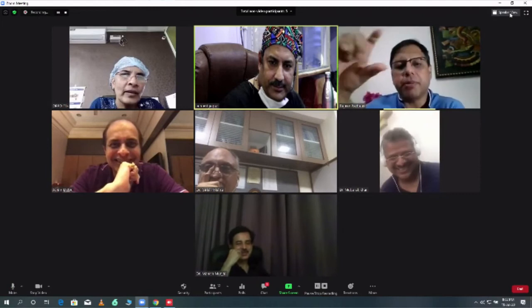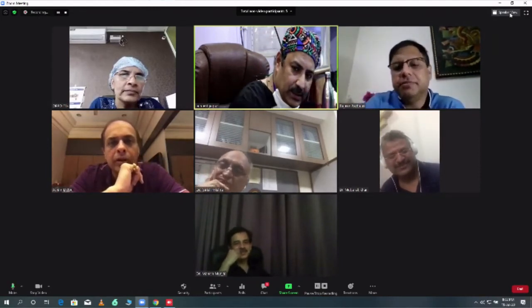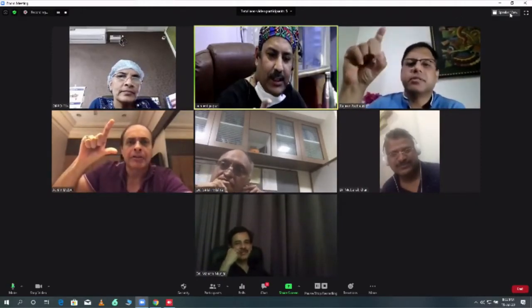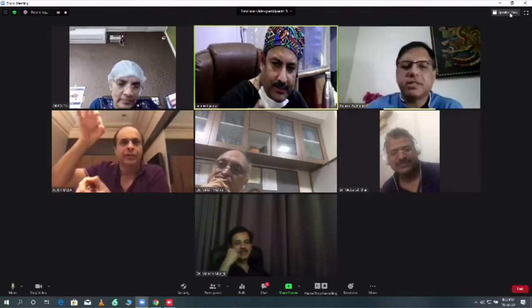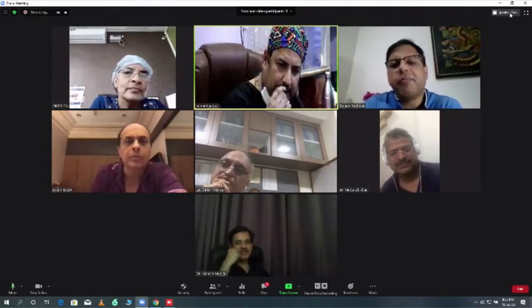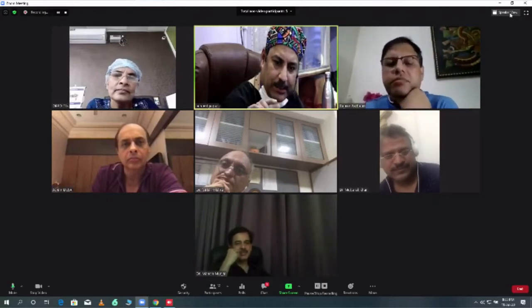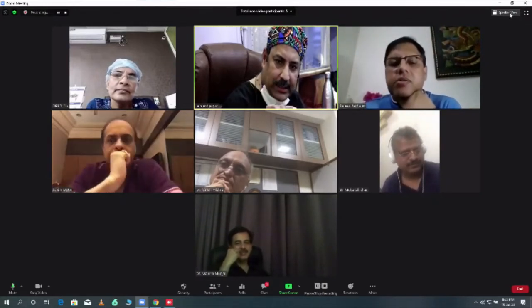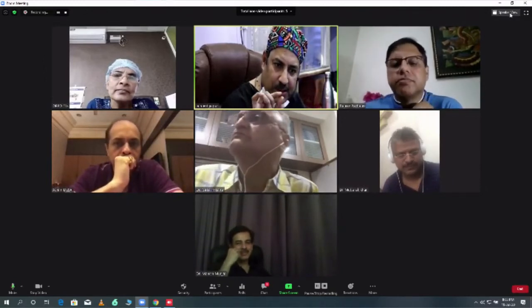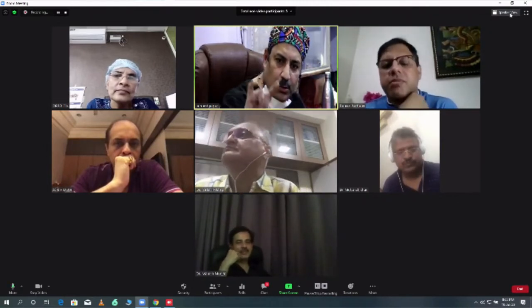Here we have seen one piston where half is Teflon and the upper one is titanium. That is also very good because for the crimping part you can manage. Yeah, but that is not a clip like this. The problem with those is that the two diverge after they are set. This is different. This clip is tiny and so calculated, the mouth of the clip, the spring is working in such a manner that you apply it close to the incus, and according to the dimension of the clip, the spring opens a little bit and the middle slot goes and takes up. So it holds tightly.